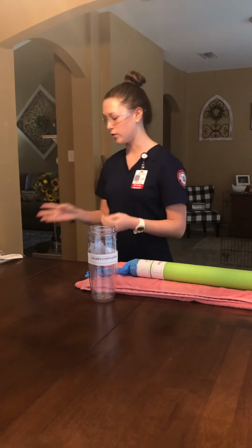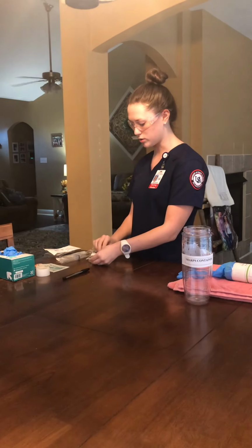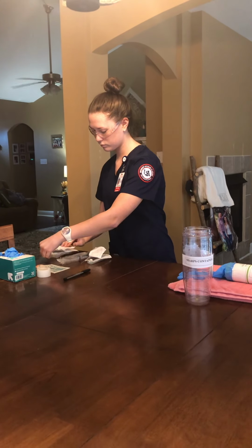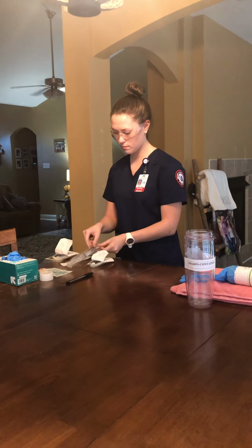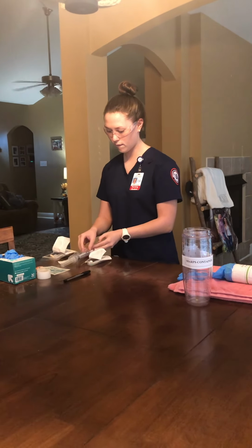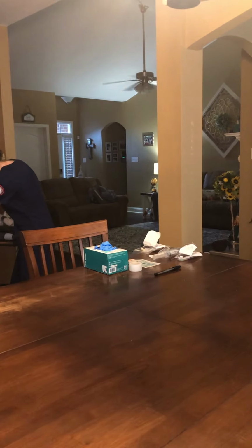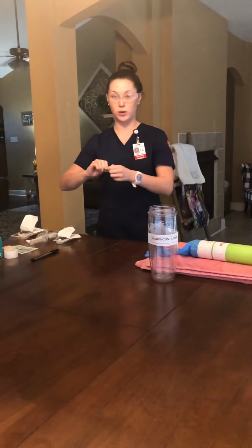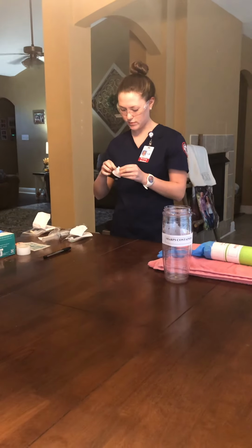So next I want to open my sterile packages. This would be on the bedside table at waist level. So I want to open and arrange my equipment. I did forget to get an alcohol swab, but I will want to now clean the injection cap.